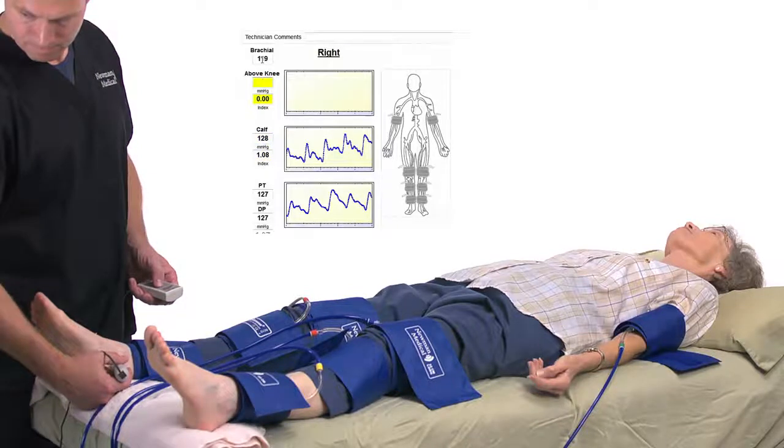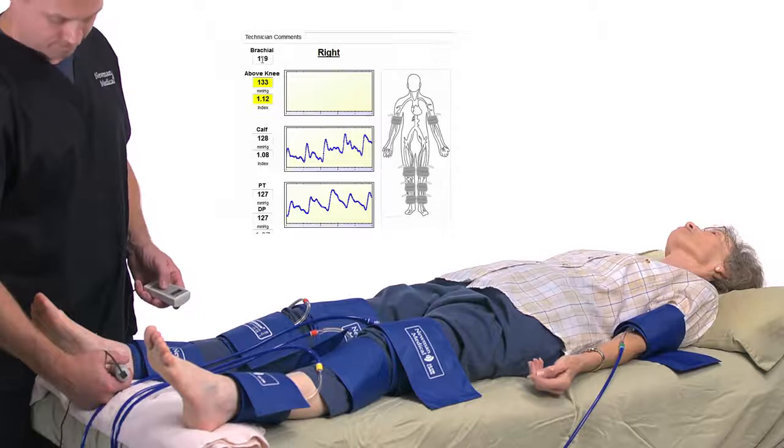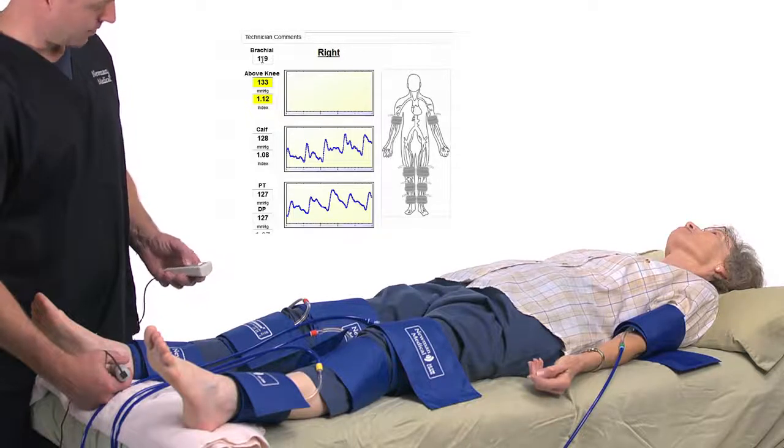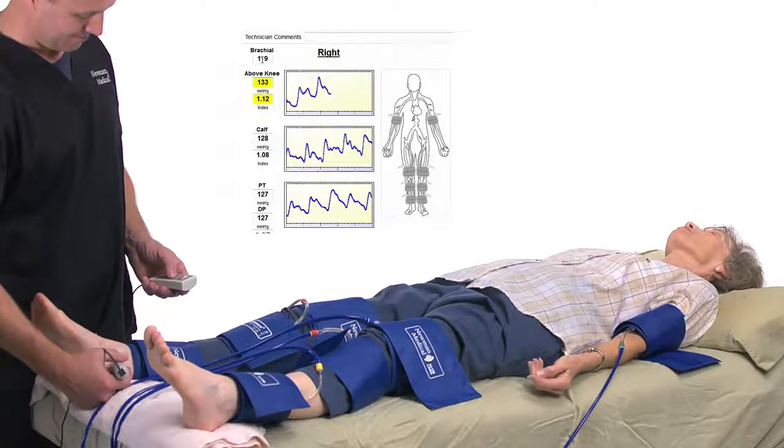Again, remember that the pressure depends on the cuff location, not the probe, so keep the probe on the ankle as before. Now use the remote by again pressing and holding Inflate until occlusion and Pressure when the blood flow returns. Press Dump to prepare to take a waveform. Press the Waveform button and wait a few seconds for the PVR waveform to appear. When satisfied, push Next and the system will move to the left brachial field.